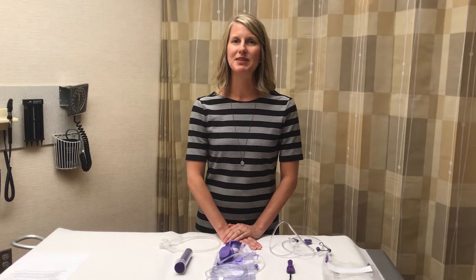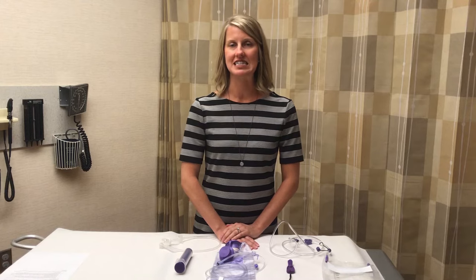My name is Lisa and I'm a dietitian at Mayo Clinic in Rochester, Minnesota. If you have a feeding tube, you may be aware that there has been an international redesign of feeding tubes and equipment. This was done for safety reasons to prevent tube feeding formula from being administered into the wrong tube.